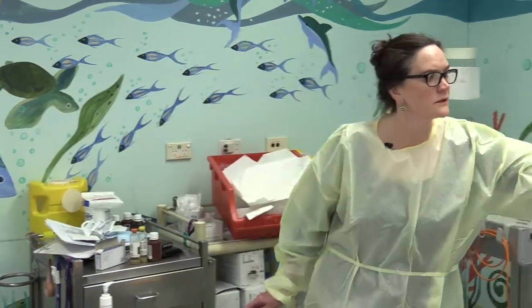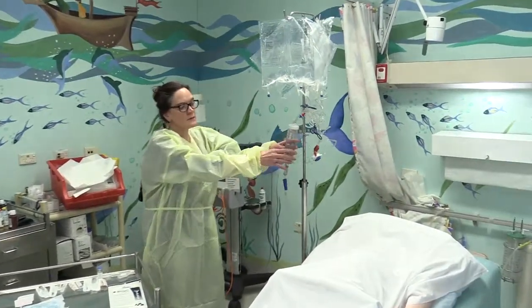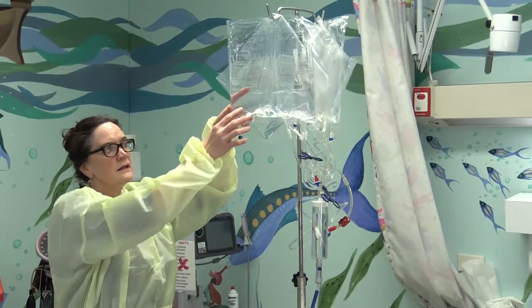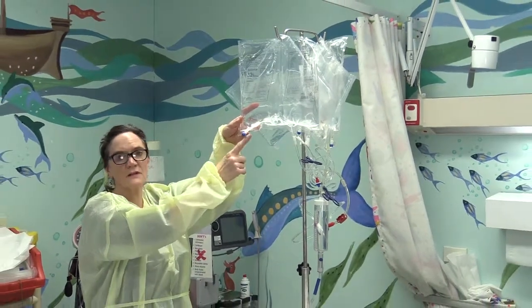with a maximum dose of 80 milligrams, and cefazolin 15 milligrams per kilogram of body weight with a maximum dose of 1 gram. And that will be added to the burette of the peritoneal dialysis set. So the antibiotics go into the inflow burette. The lignocaine and the heparin will be added to the injection port of the dialysis fluid bags.